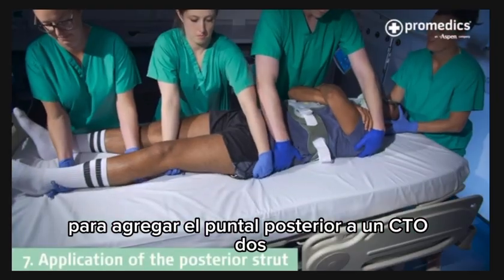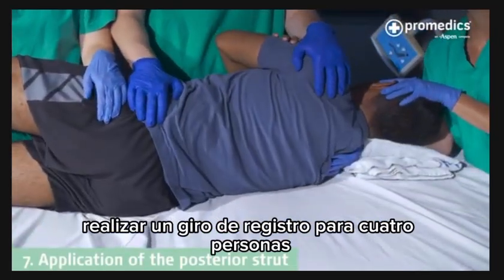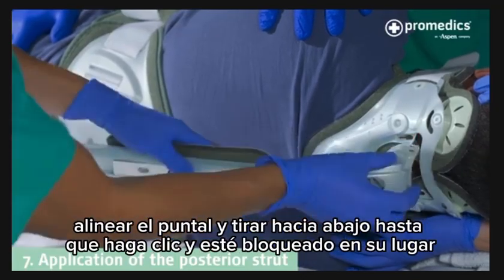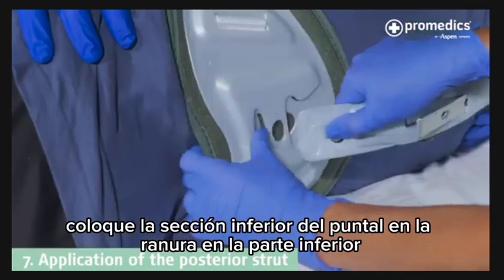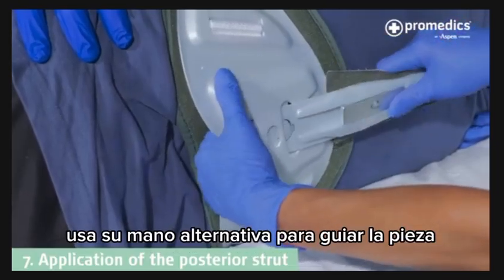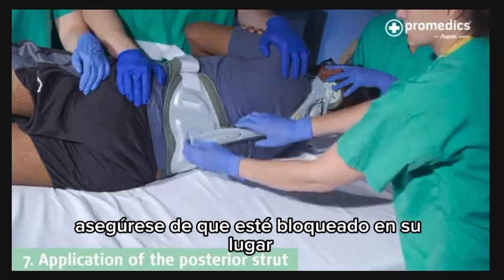To add the posterior strut to a CTO2, perform a 4-person log roll. The strut will align and fit into the 3 slots shown. Align the strut and pull down until this clicks and is locked in place. Place the lower section of the strut into the slot at the bottom. Use your alternative hand to guide the piece in from behind the brace. Ensure this is locked in place.